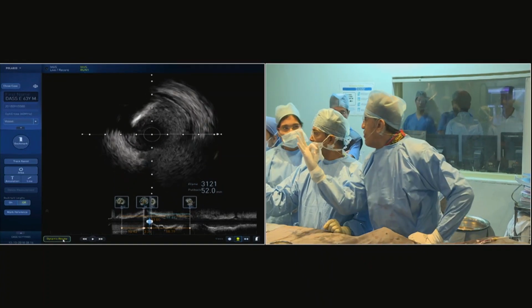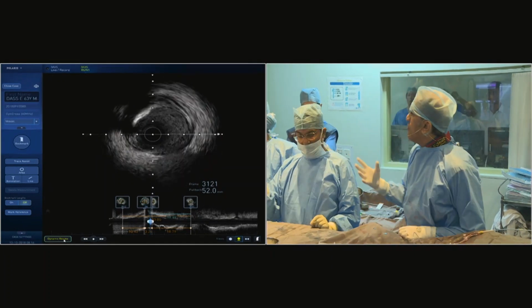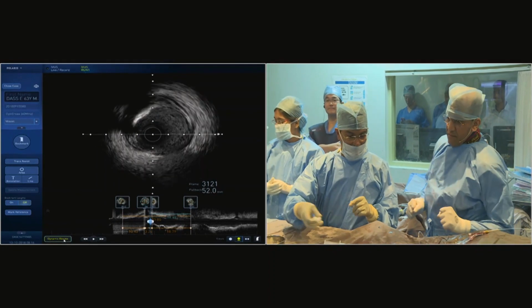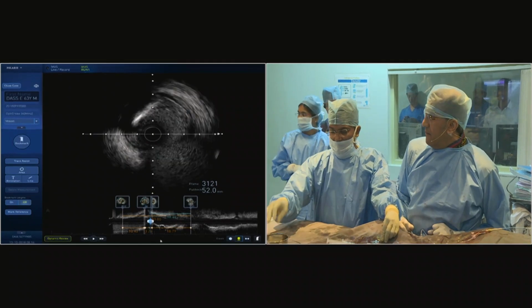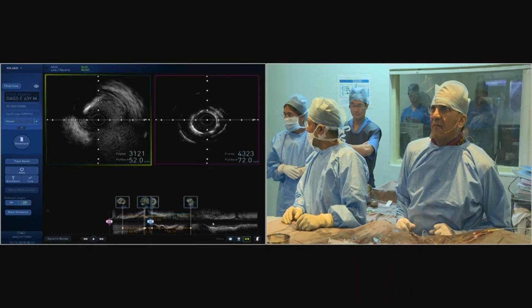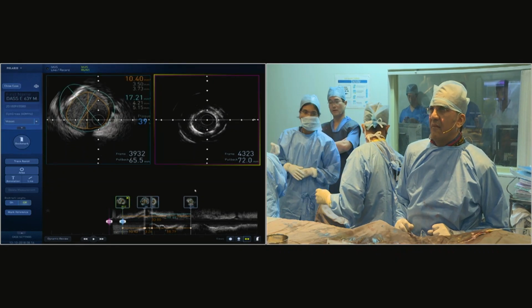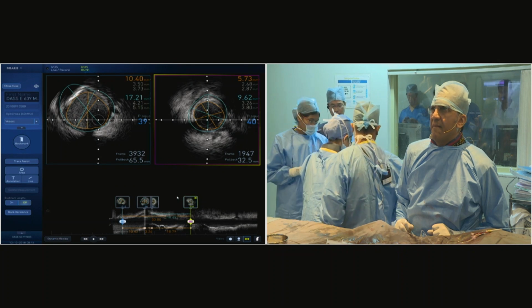Thank you. I can give a 3 by 6, or a 2.75 by 6 then. Oh, give me a 3 by 10, that's okay. 3 by 10 is okay. It gives an indirect clue that in some studies, if they just interrogate the distal left main and it's less than 6.1, then the likelihood of LCX compromise is higher. If you don't want to put a catheter into the LCX, personally, I would do a pullback from the circumflex to the left main as well.